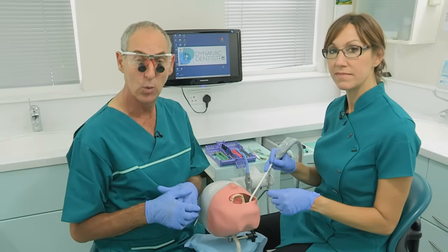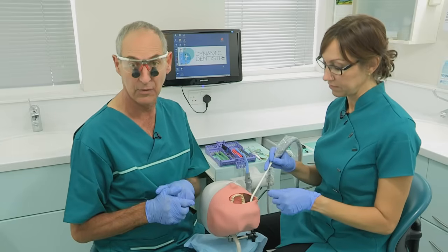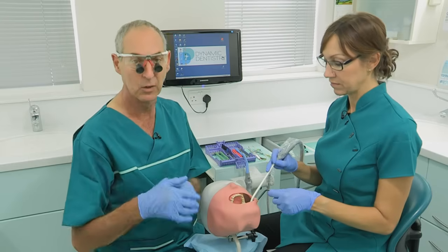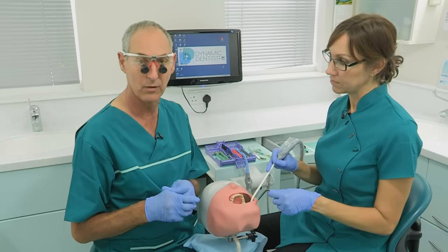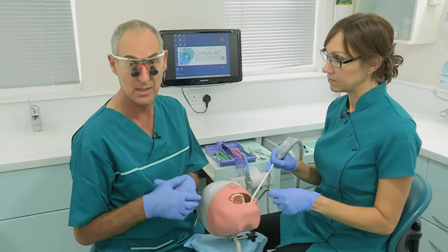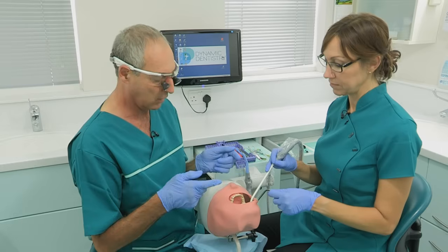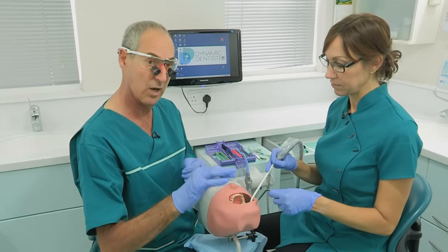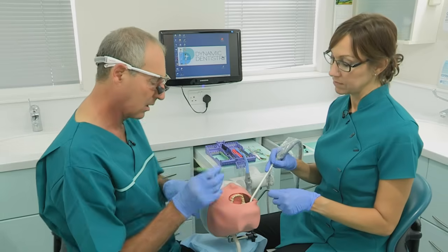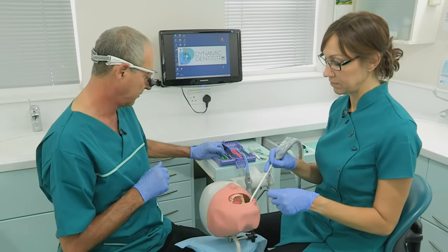We know this technique works for all procedures in dentistry, and of course everybody out there does their procedures differently. So if you come on one of our courses, we can teach you individually that's tailor-made for you, or come into your practice and do it there and then. But I use it for everything, even implants, when I have either four-handed or six-handed dentistry. And in this case there is something slightly different, because I might want my nurse to actually stay in the mouth, retracting the flap and aspirating. But I can just pick up an instrument very easily, come round to the patient, do whatever I want to do, and then go back again.